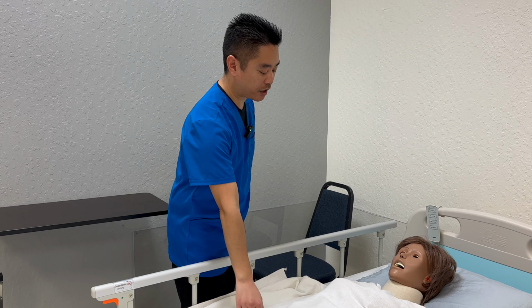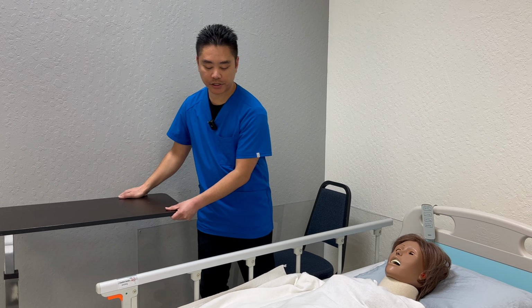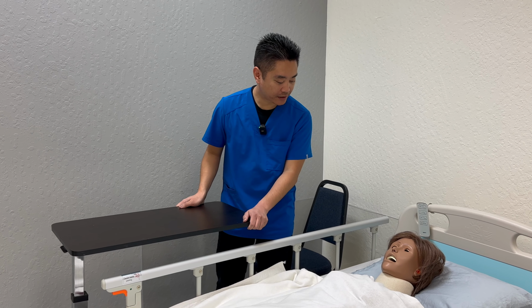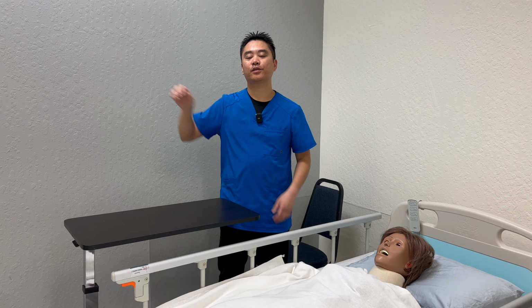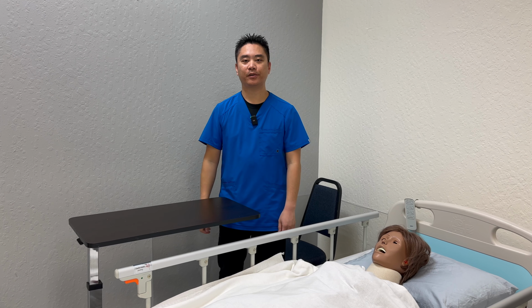Mrs. Smith, here's your call light. Here's your phone, tissue, water, and magazines. If there's anything else you need, just let me know and I'll be back. So I'm going to open up the curtains, wash my hands, step outside, record, and report.